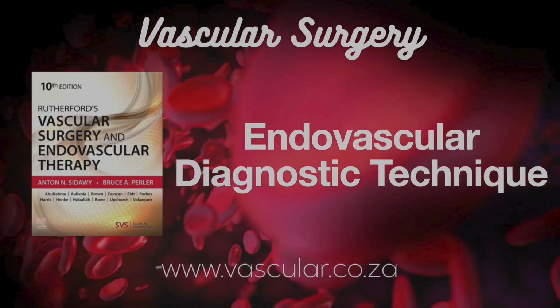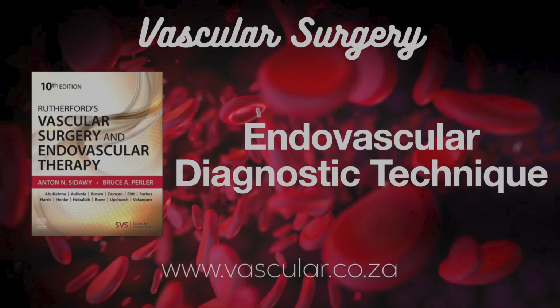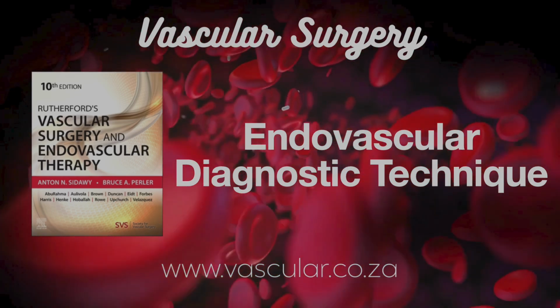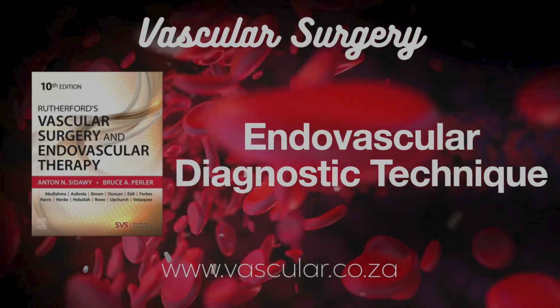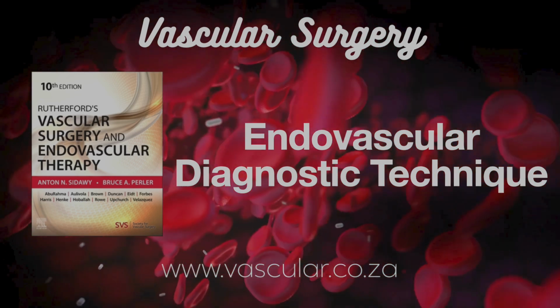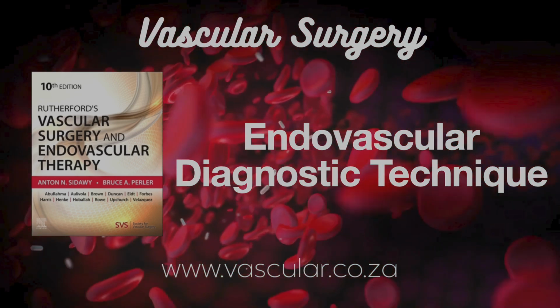And the techniques. Micropuncture is very common now, right? It is probably the most common. Usually uses ultrasound, maybe fluoro too. You use that fine 21 gauge needle, shallow angle, 30-45 degrees. Then what? Get blood return, then carefully advance a thin 0.018-inch floppy tip wire. Watch it on fluoro to make sure it's tracking. Okay, no dissection. Needle out, then sheath.